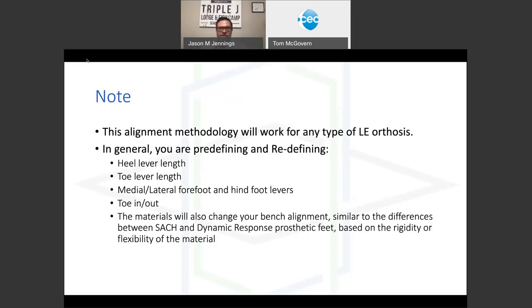It just depends on, is the orthosis designed with materials that are appropriate. So if the patient has enough muscle strength to perform the task, you don't need as much strength as if they don't. But if you design an orthosis that doesn't have enough rigidity that the patient's normal muscle strength would have provided, you're going to end up with compensations or an abnormality.